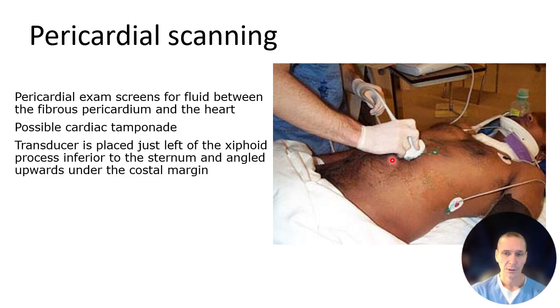Now, you're going to see how we can roll through the liver and find the heart that way. I have found to just kind of visualize where the heart is and imagine that you're holding some sort of flashlight or something and just pointing towards where you think the heart is works the best. However, this may be different for others, so we'll show you several ways.